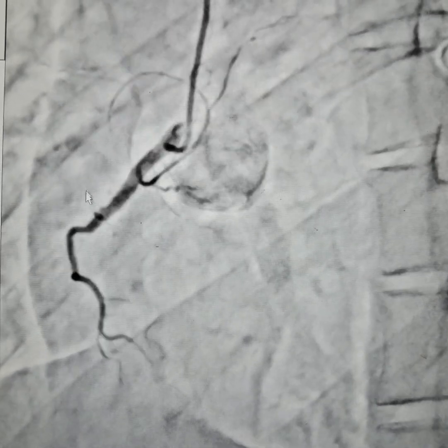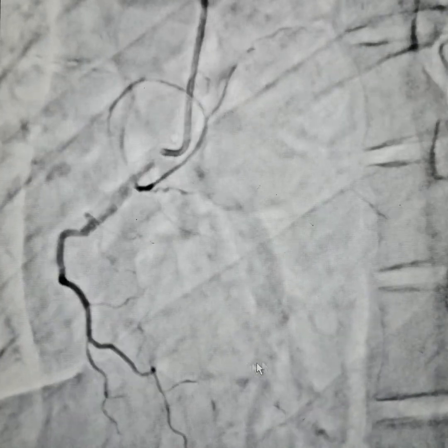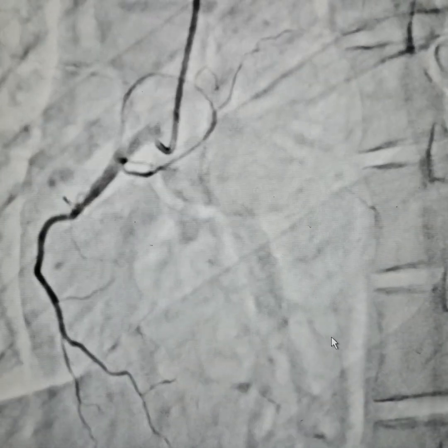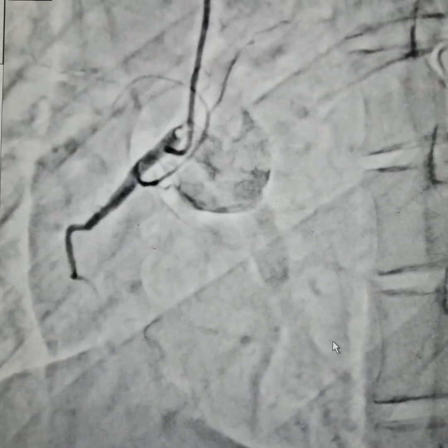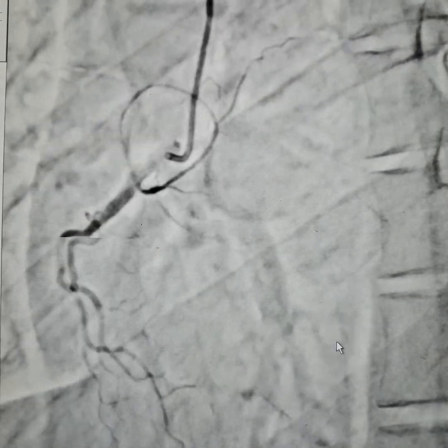Hence, we estimated that the RCA should be opening somewhere here, where I am pointing the cursor. The patient had continuous chest pain in the past 4 or 5 days and he was a chronic tobacco user. Hence, all the more reason to suspect.